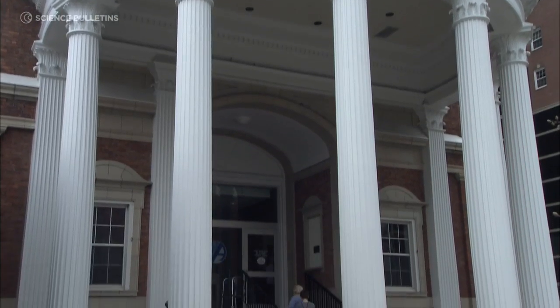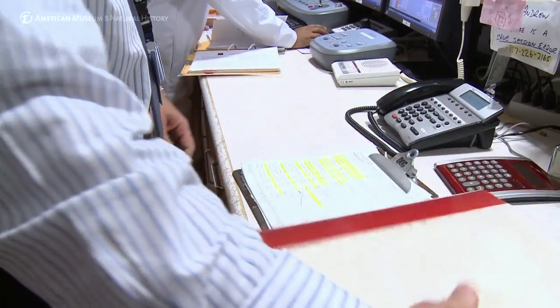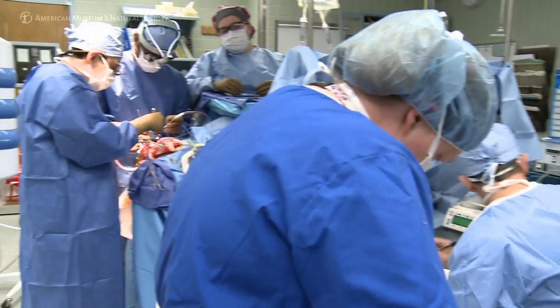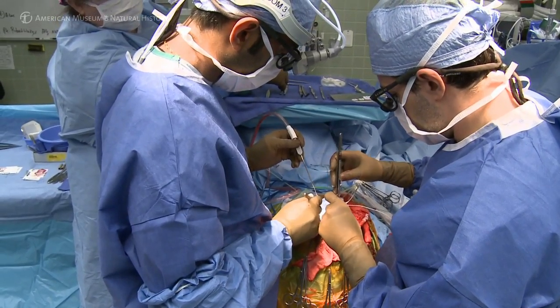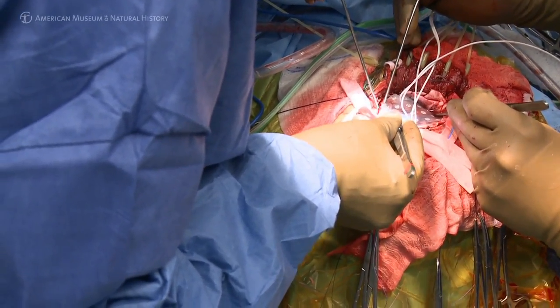You don't have that with ECOG. ECOG is our abbreviation for electrocorticography, which essentially means listening with an electrode or recording device directly on the surface of the brain. The people in whom we implant these devices represent a large number of people with seizures in whom medicines just don't work to prevent seizures. The only way we can understand the discrete location of where their seizures are coming from is by recording at the level of electrocorticography.